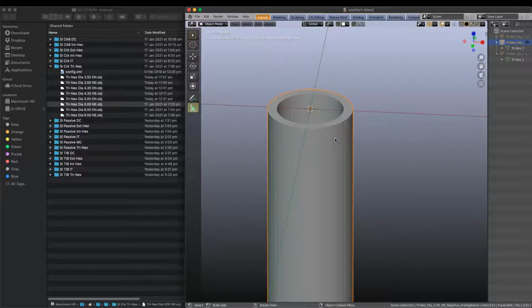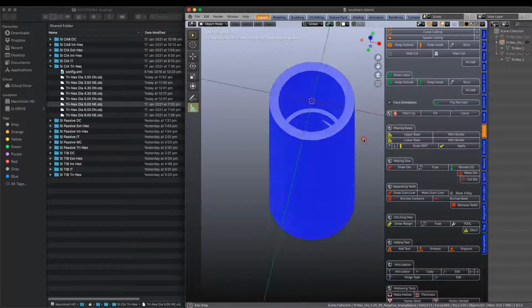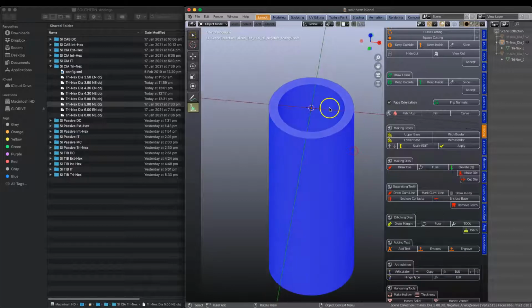So if I go into the model designer now, press the N key, and press face orientation, all of the vertices, the normals are in the correct order. Initially when we started, the red would be on the outside, which is okay for other CAD software where they're going to just connect the mesh geometry onto the scan and then make a model.